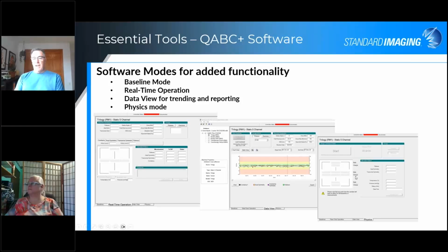And you can see your flatness, your symmetry, both in axial and transverse, and use it in a research phase, or if you want to set up your own types of tests with the device, you can do that as well.